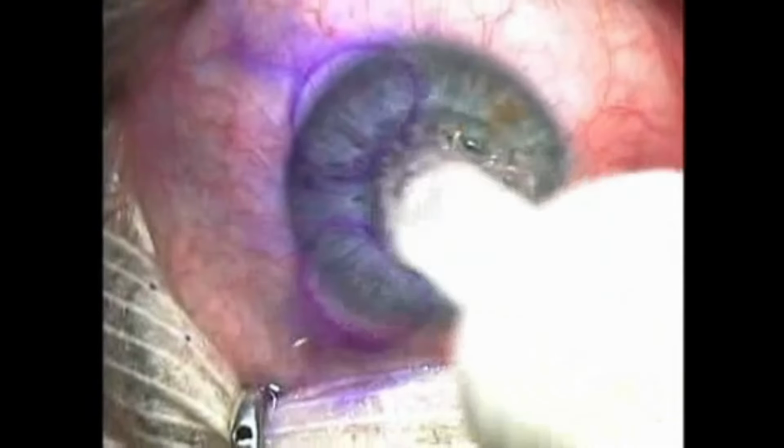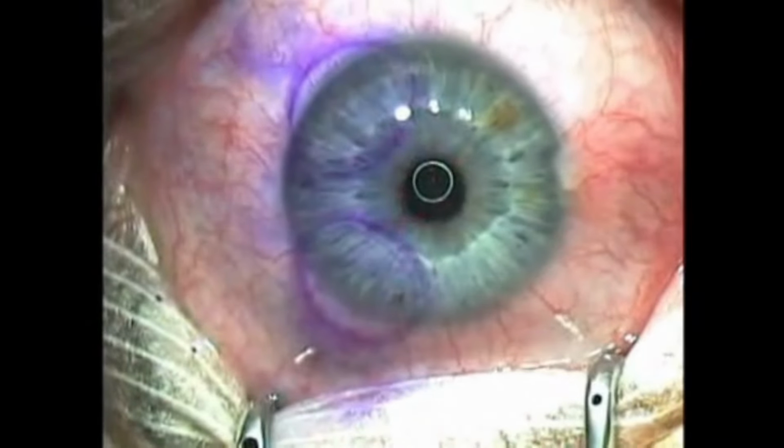The epithelium is marked, just as in LASIK. The Moria EPK microkeratome is emplaced, being displaced slightly nasally with a 7.5 mm stop. Suction is obtained. Following this, gentle preservative-free drops are placed both on the separator and also on the cornea, allowing excellent lubrication. Position 2 of the foot pedal is engaged until the epithelium begins in the separator.